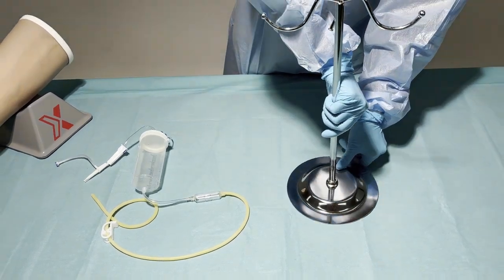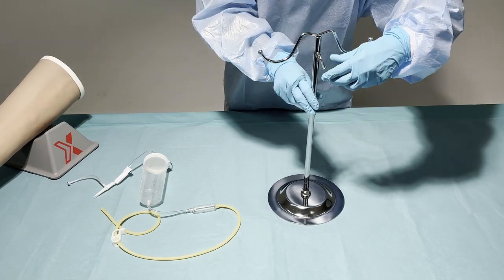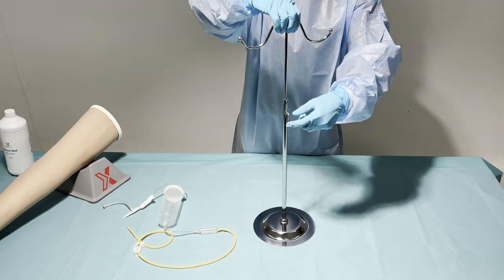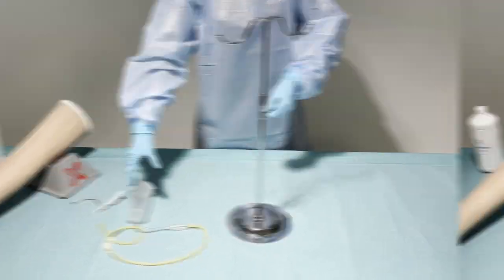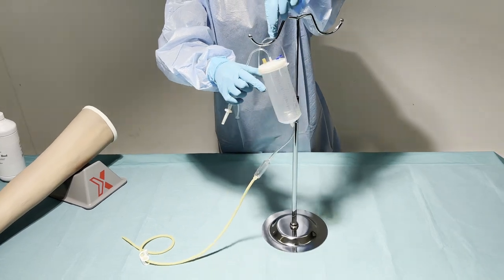When the IV stand is screwed firmly on the base, we can adjust the height of the IV stand. And now we can hang the IV bottle on the IV stand.